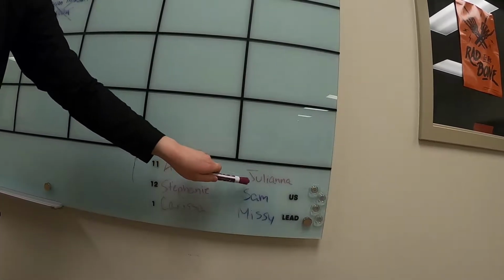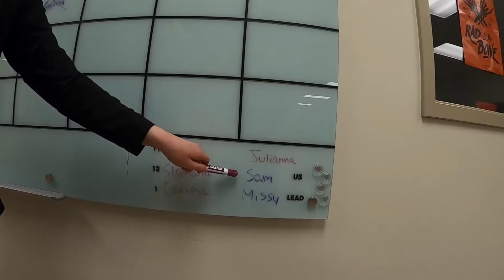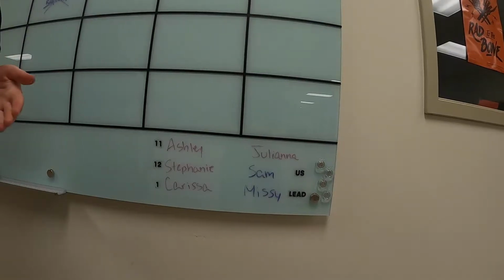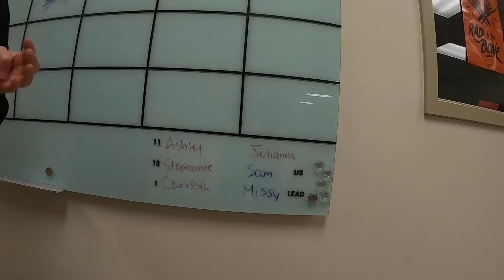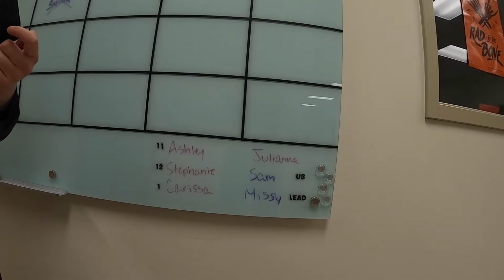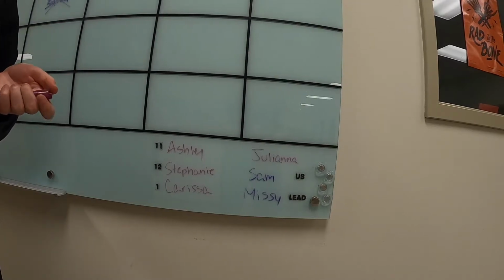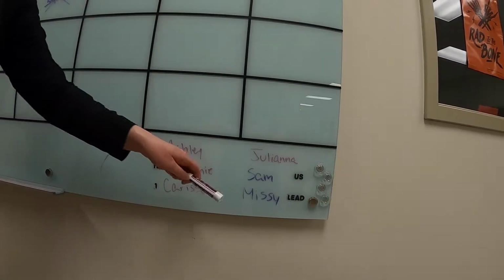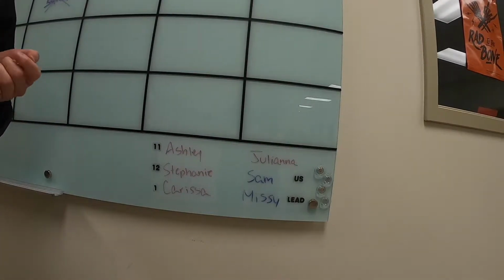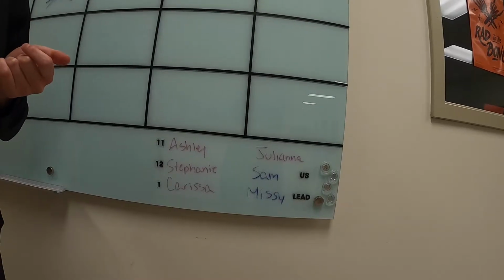Then we have the ultrasound and the lead student over here. So the ultrasound student is pretty much in charge of making sure the patient arrives on time. The service that the ultrasound is coming from is in charge of bringing the patient down. But if you notice that the patient isn't here on time, you can let one of the techs know so we can contact the service. And then the lead student is in charge of coming up front, seeing if we have any requests, taking the images, and positioning for the images.